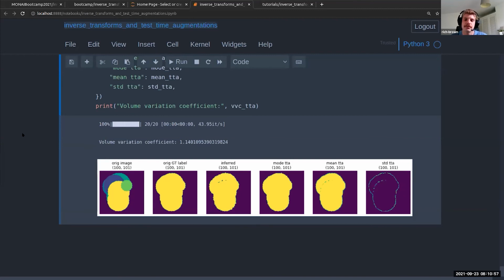Yeah. Great. There's two questions that are pretty similar here. It was, what's the point to transform the test data and perform the predictions using the pre-trained model? An extra level of checking if the model overfits? Kind of wondering why. Sorry, could you repeat that one? What's the point to transform the test data and perform the prediction using the pre-trained model? Yeah, so there's a couple of things there.